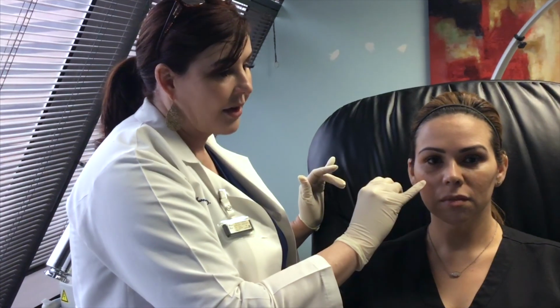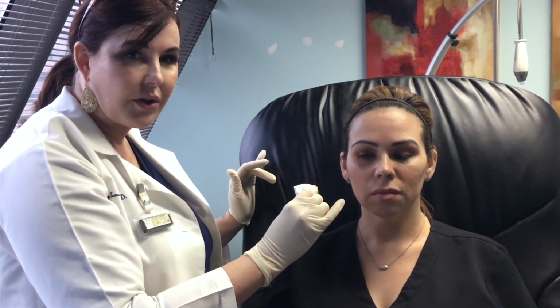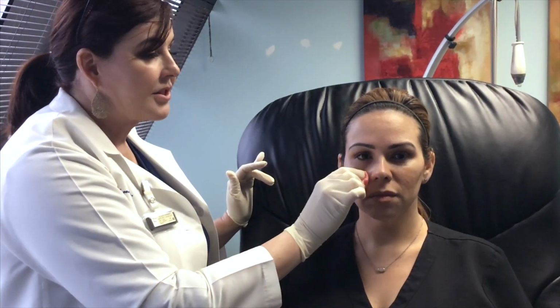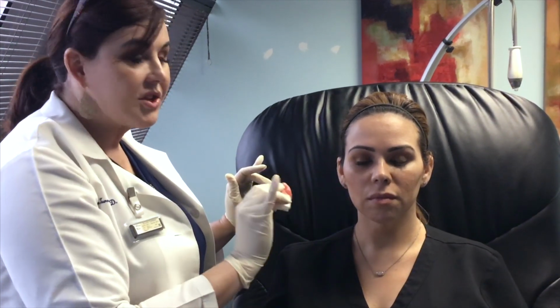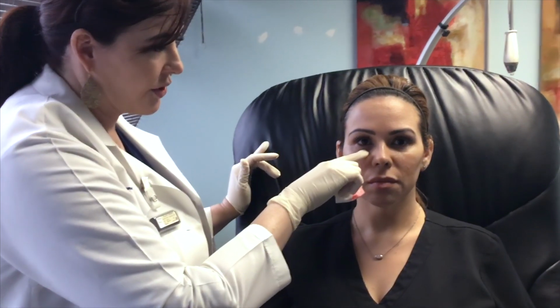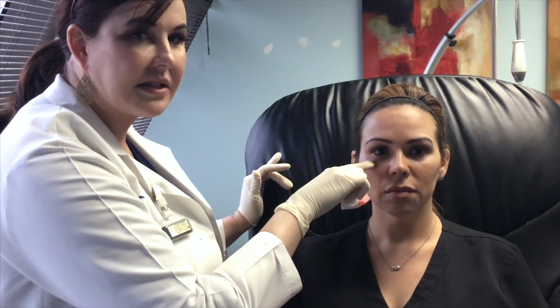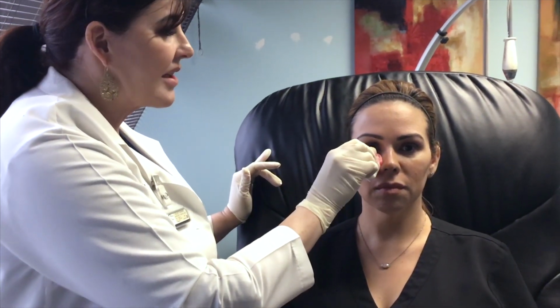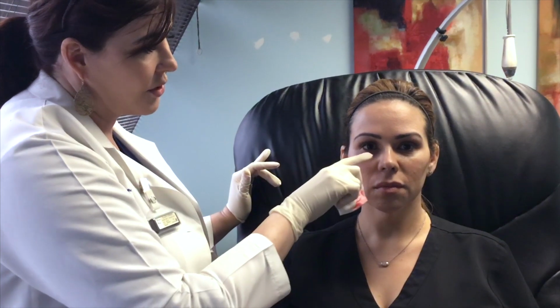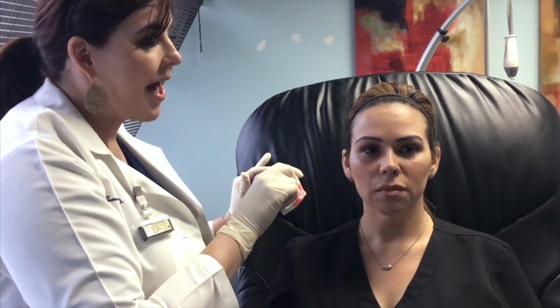This is a natural process that happens with aging, and we can re-volumize these areas to give the necessary volume replacement to give the desired effect. So we're going to use Voluma on those areas, and then as we go closer to what's known as her tear trough, this is where if she had a tear, it would just fall along this fault line basically. And we can use a specific filler to replace volume here in the tear trough itself. For that, we're going to use a product called Volbella.